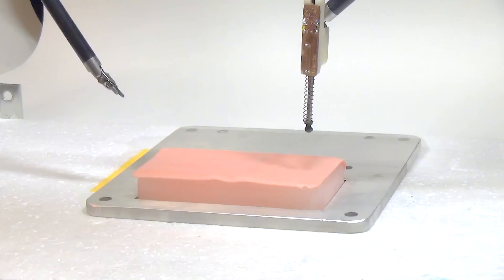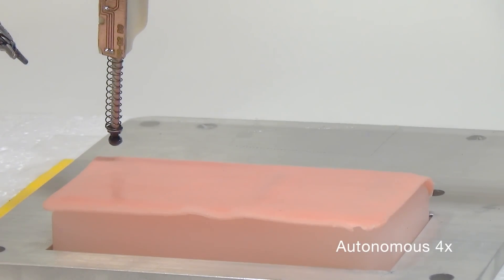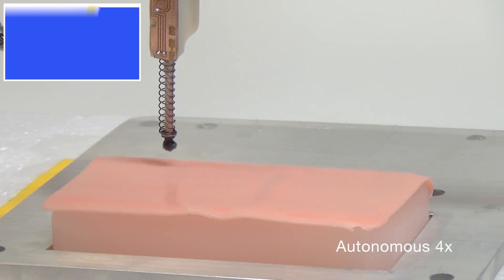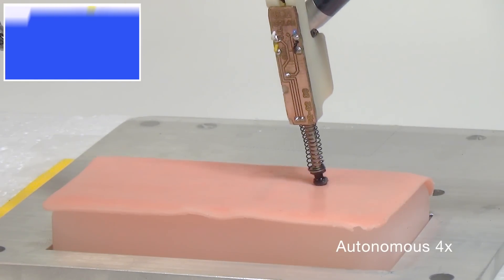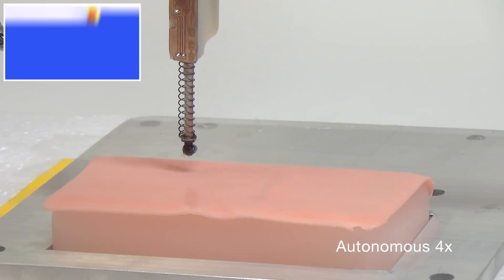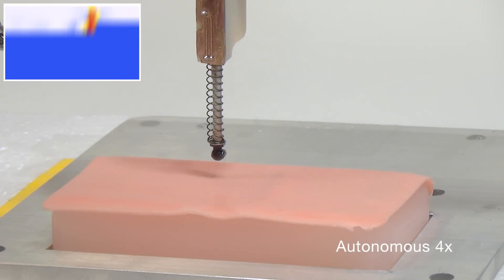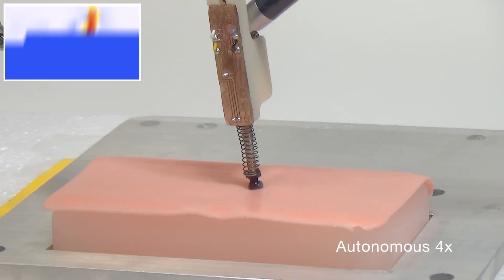This video demonstrates a successful trial of the entire five-step procedure, where human input is required only at four points to change tools. We use silicon-based tissue phantoms with silicon rubber cylinders to represent the tumor. One tumor is placed in a random position under the silicon skin layer.